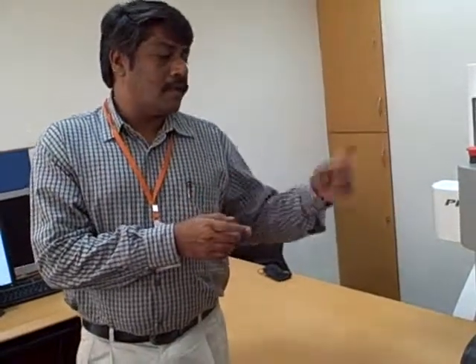We have ensured that this is kept available for the doctor. Typically, if you have the robotics driving the needle, the doctor would not get the feel. So let's say you have an uncooperative patient. He gets worried, excited, anxious, and he wakes up and gets up from the table. If you have the robotic driver pushing the needle, you have a very clinically complicated condition. So to ensure that the procedure is safe, we allowed the doctor to manage the final insertion.